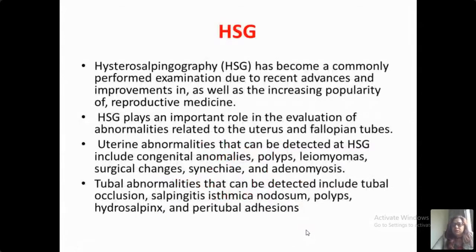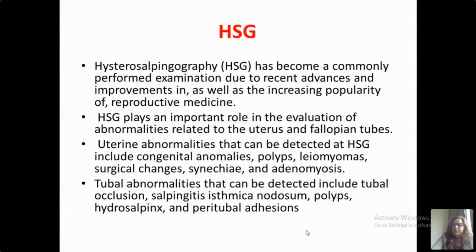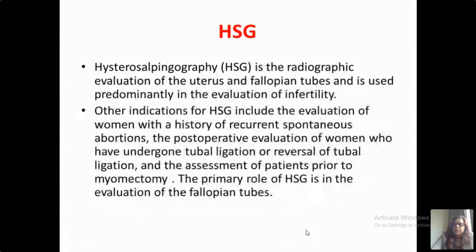Hysterosalpingography is the first and foremost modality for imaging the tubes. It has become a commonly performed examination due to recent advances and improvements as well as increasing popularity of reproductive medicine. HSG plays an important role in the evaluation of abnormalities related to the uterus and fallopian tubes. Uterine anomalies that can be detected at HSG include congenital anomalies, polyps, leiomyomas, surgical changes, synechiae, and adenomyosis. Tubal abnormalities that can be detected include tubal occlusion, salpingitis isthmica nodosa, polyps, hydrosalpinx, and peritubal adhesions.